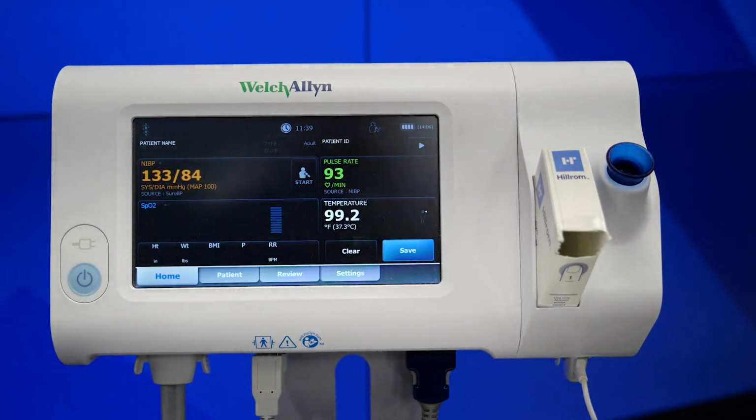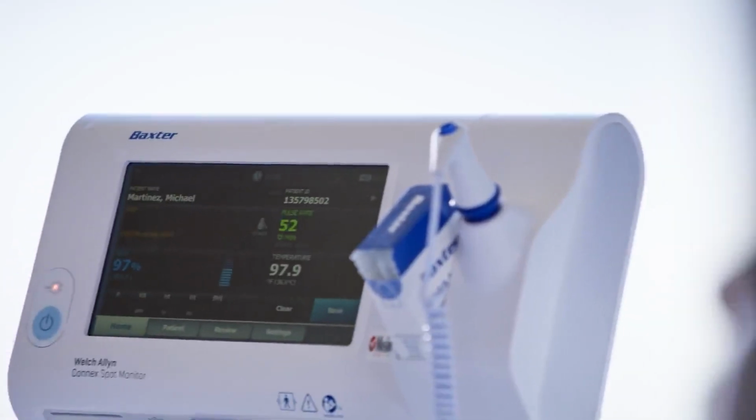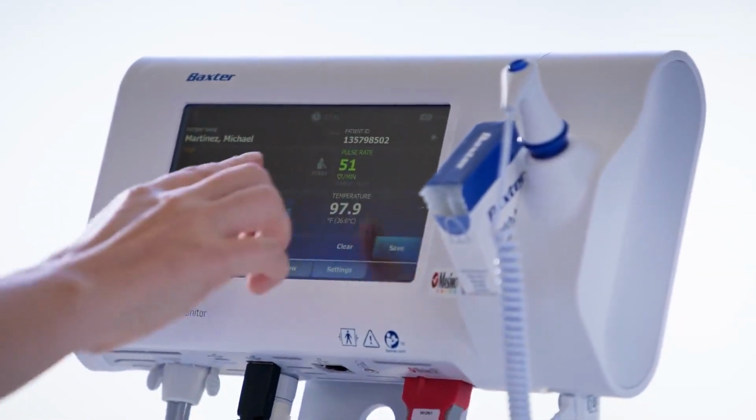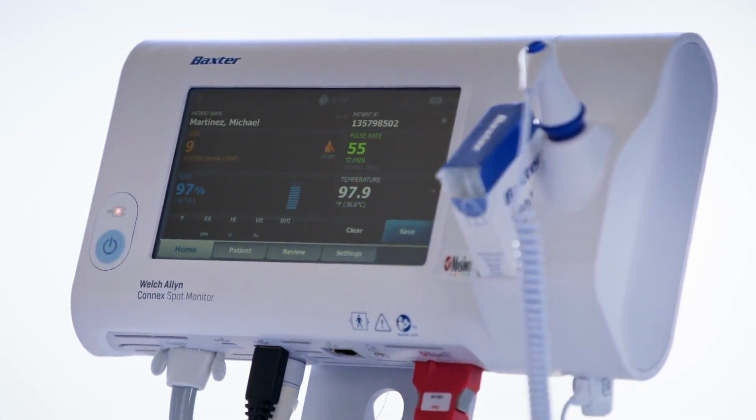Dispose of the probe cover and set the probe back into the probe well. The SureTemp Plus technology in our temperature probe contains a preheated filament that reduces the time to take a reading by bringing the probe to body temperature prior to measurement.